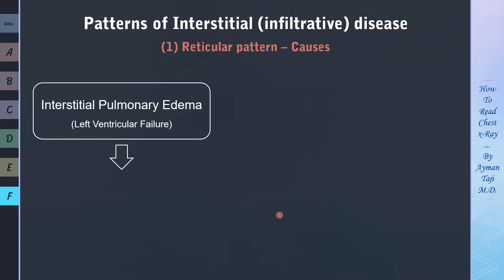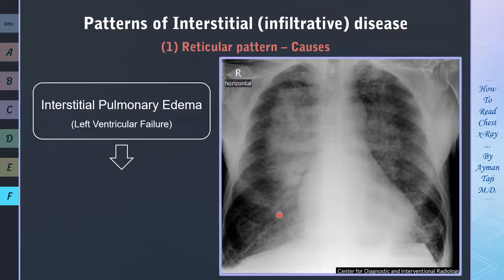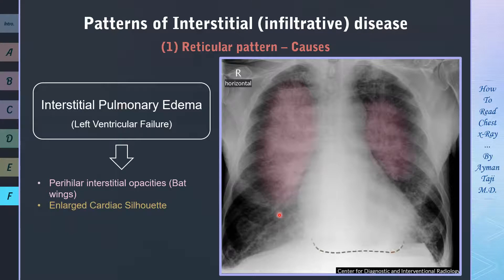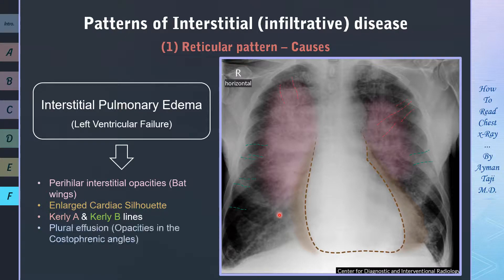On a chest X-ray of a patient with left ventricular failure and interstitial edema, you can see hilar interstitial opacities giving the hilar shadow a butterfly or bat-wings appearance. The cardiac silhouette appears bilaterally enlarged, indicating cardiomegaly. There are thin linear opacities radiating from the hilum to the apex — we call these Kerley A-lines — and lines from the hilum to the periphery of the lungs, called Kerley B-lines. The costophrenic angles also appear covered by an area of increased opacity, suggesting pleural effusion.